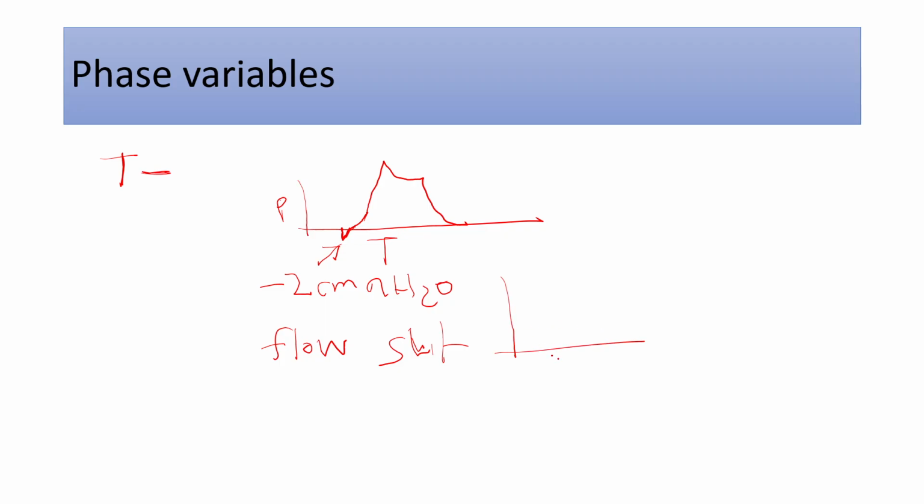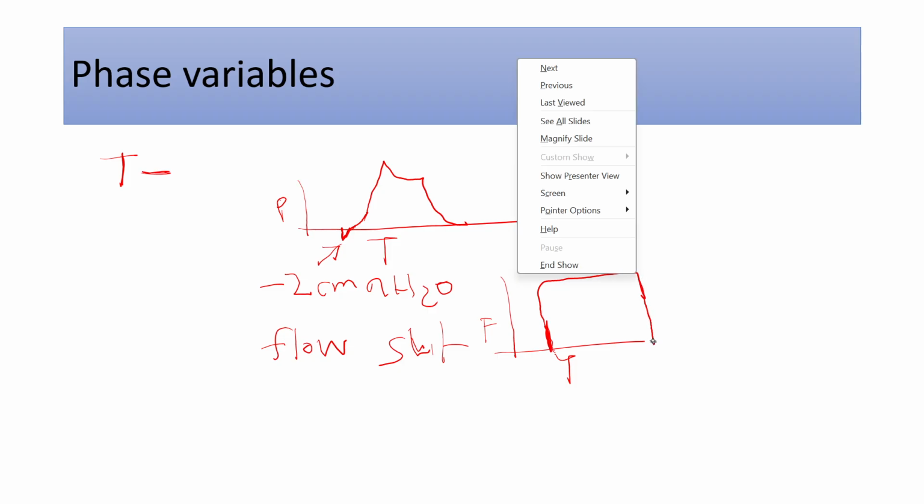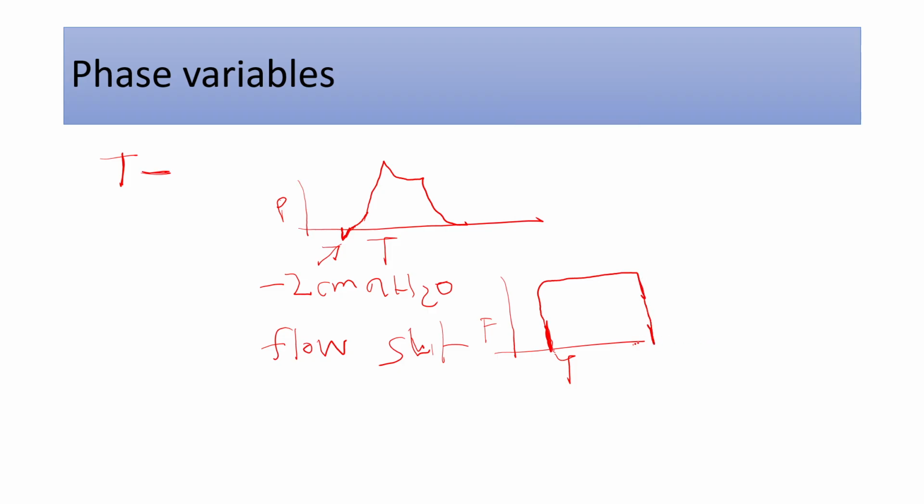So in the flow time curve, if this is time and flow, the initial flow generated by the patient, 4 to 5 liters, will be depicted by some color here. So the patient has triggered, and then the flow is generated till the inspiration limit, volume limit, and cycles to expiration. So this is the flow trigger.